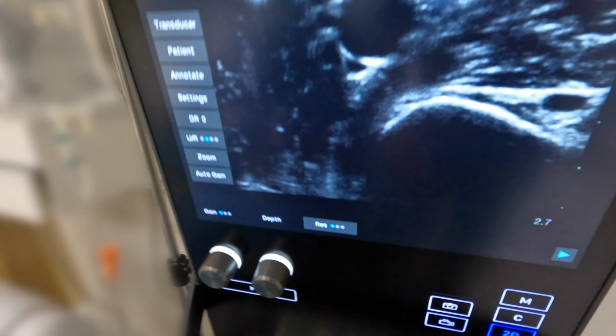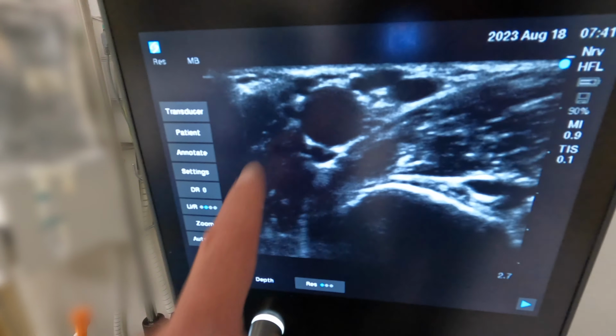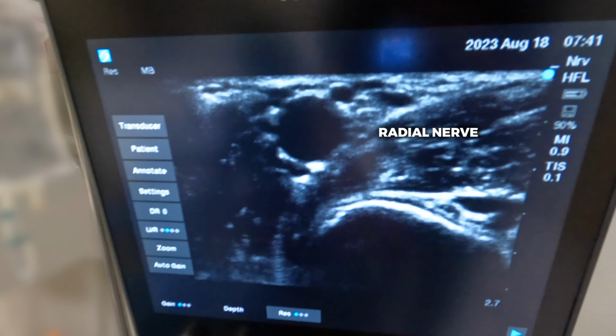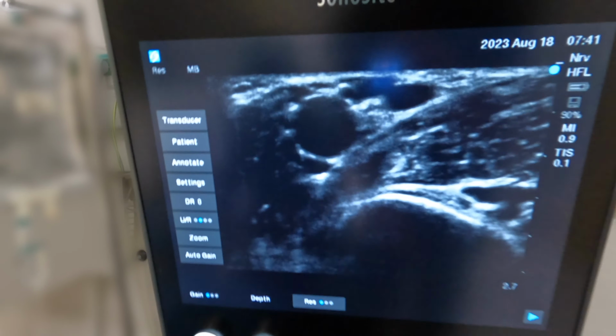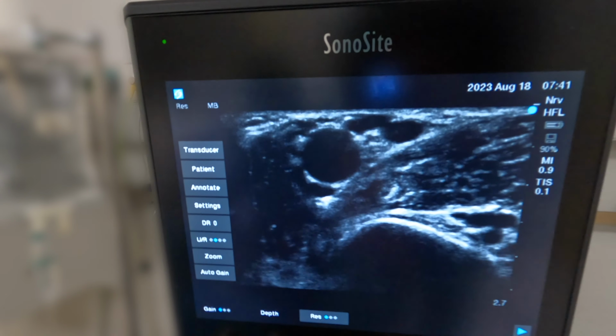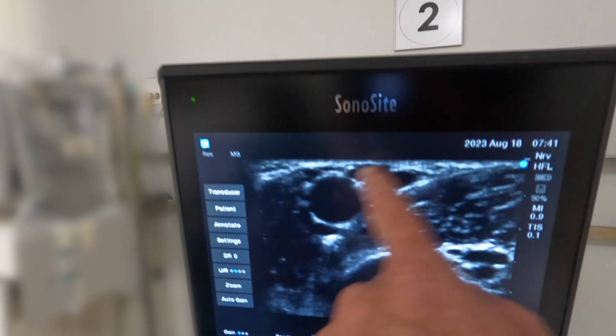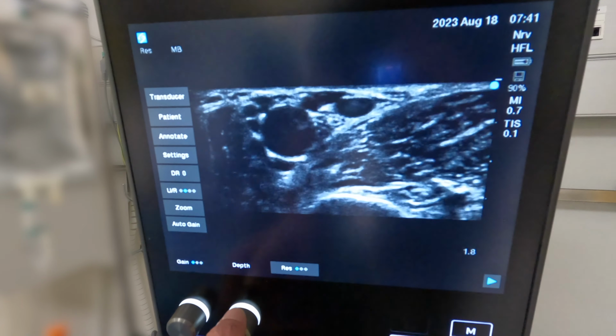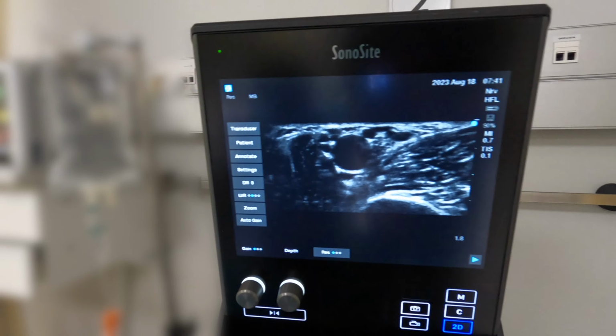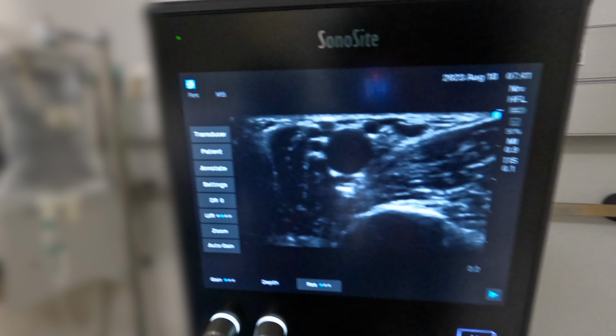We're ready to go. If you look at the anatomy here, we can clearly see that there's a median nerve, that's a radial nerve, and the ulnar nerve is likely somewhere here. But you see, we have to be careful working around this anatomy to make sure that we avoid the vasculature inside. So let's decrease the depth. You just need maybe 1.8 or 2 centimeters depth.